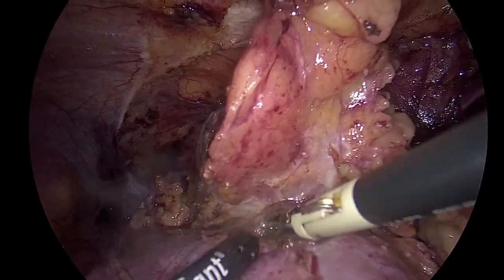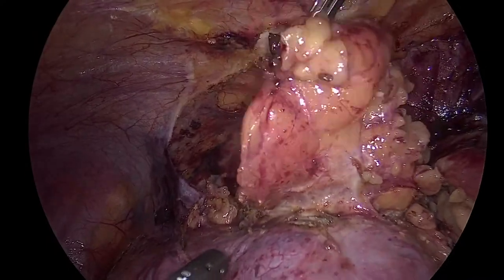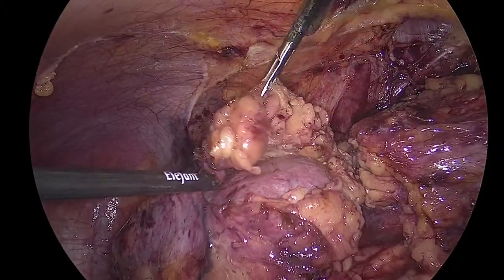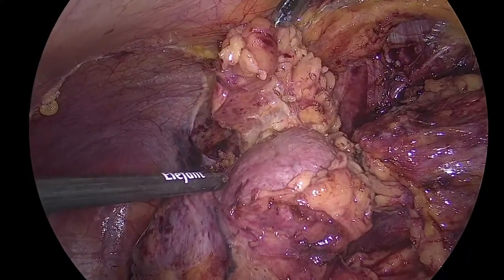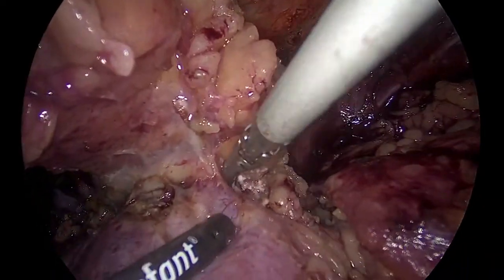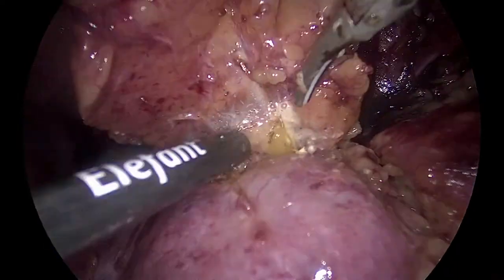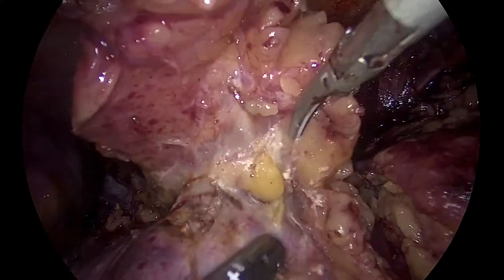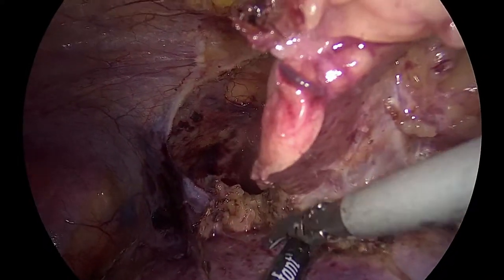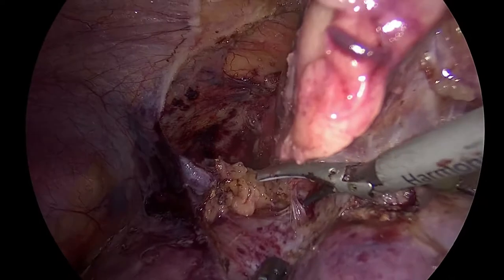And I don't want to clean it from the fat on top because now I have my assistant nicely pulling on it. I will redirect him. Leave it to me for a second. I will redirect him. Show me. Good, up there. Okay, come in. Good, show me here to the right. Seems very strange, very superficial, if it is a tumor. Show me to the left. It would be funny if at the end it's not a tumor. This looks like a tumor here. Show me to the left. It looks like it. Yes. Show me to the left.